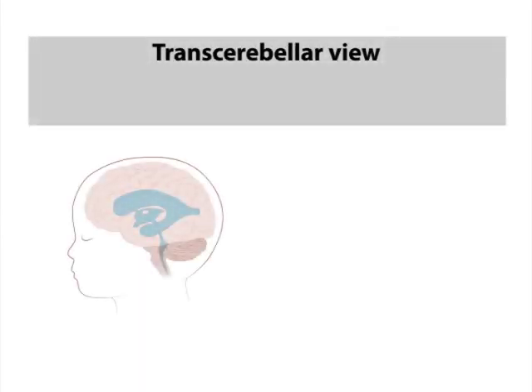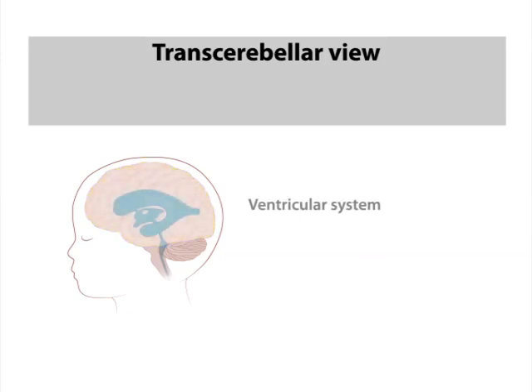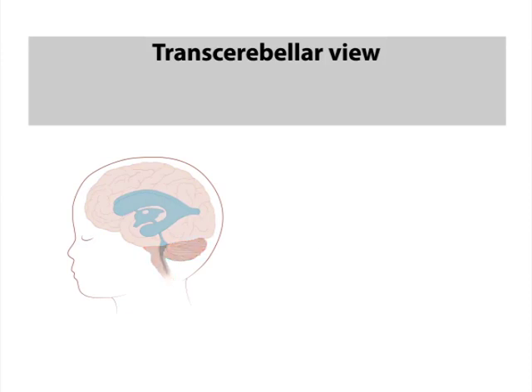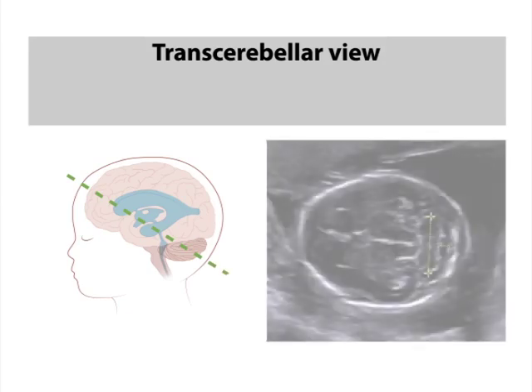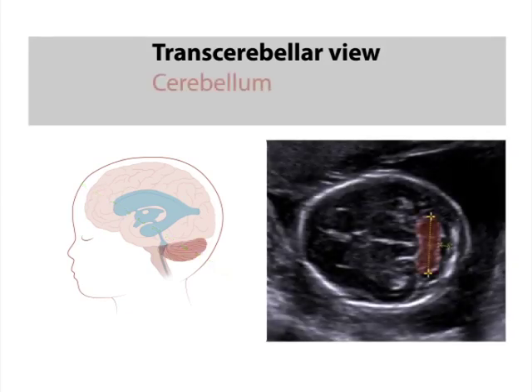In this image, the cerebral cortex, the ventricular system, and the hindbrain are seen. The transcerebellar view is an axial or transverse image of the fetal head, obtained by angling the transducer back through the posterior fossa. This view includes the cerebellum, shown in brown in both images, and the cisterna magna shown here in blue.